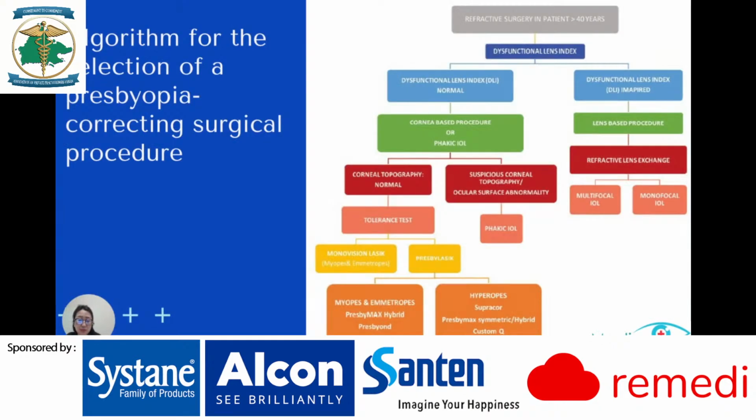So this is a simple algorithm that we follow when a potential refractive candidate in the presbyopic age group presents to us for a refractive surgery consult. Based on the diagnostic imaging, screenings, and also clinical examination, we will then determine whether a patient will fall under a corneal-based or a lenticular-based procedure for the correction of presbyopia.